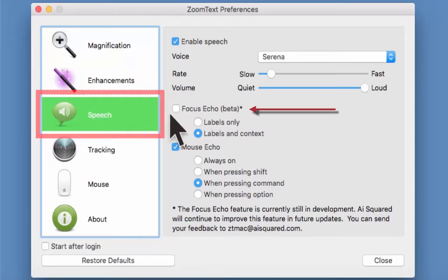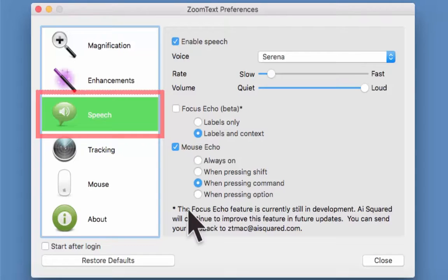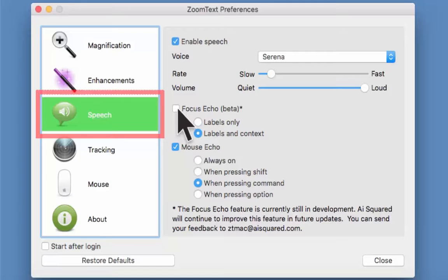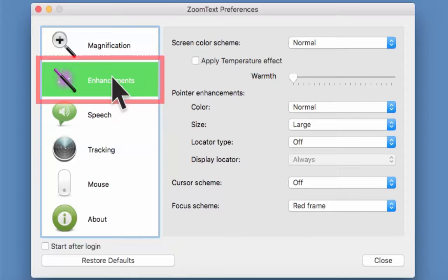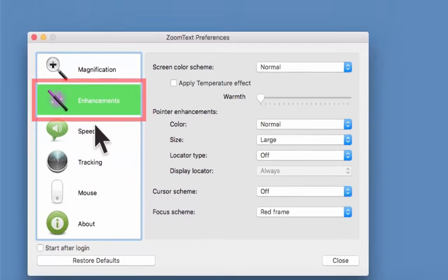Now let's look at Speech. There's a beta option here and at the bottom it says the Focus Echo feature is still coming — still in development. What this does is echo back information depending on where you are and what you're hovering over. This can be really useful if you're not sure where you are in an application. At the moment it's turned off — I'll tick it on. There are two options: Labels Only reads back the main option you're hovering over, or Labels and Context gives more information.